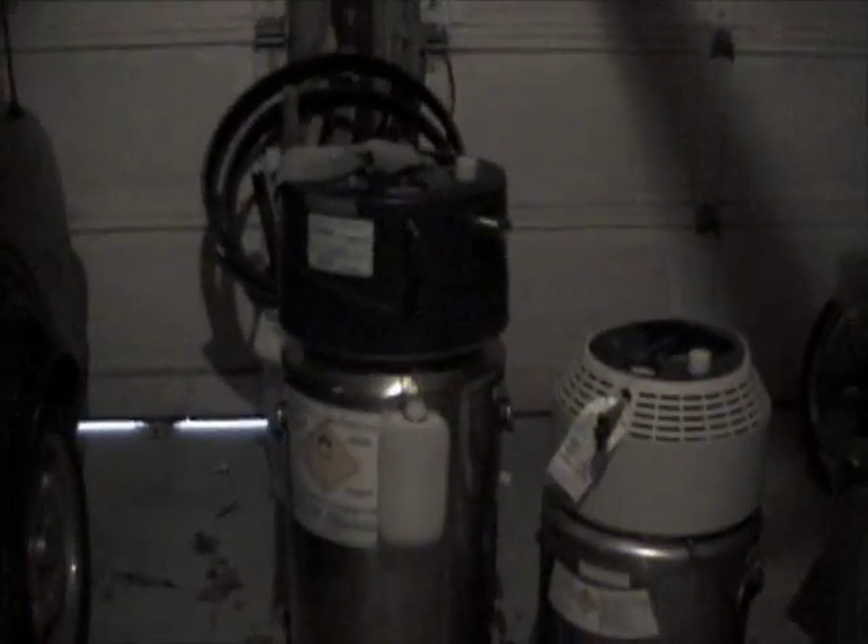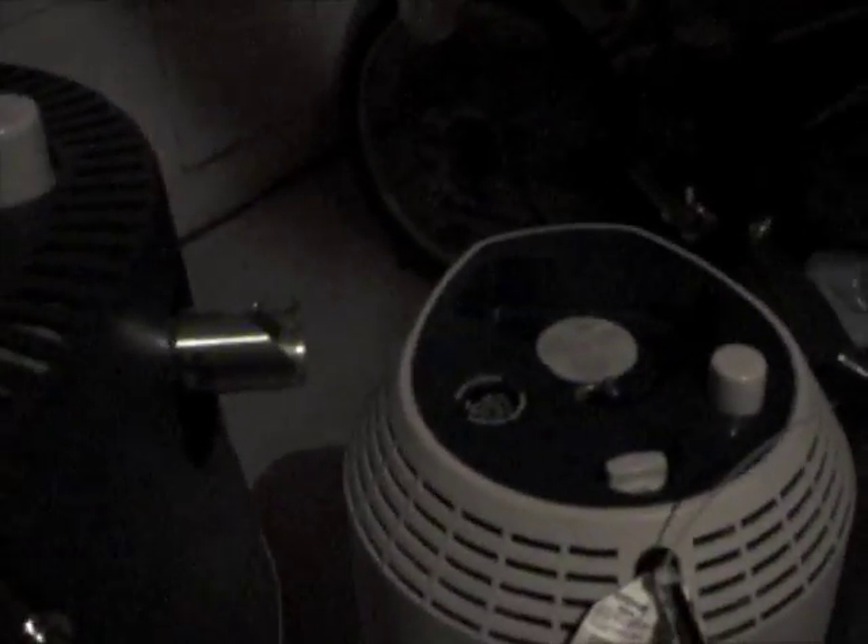Over here there is a silhouette of a regular sized garbage can so you can see how high a garbage can is. This is the smaller refill unit that they gave us near the end, so that we could have that in the back of our van all the time for refilling the little portables to commute into my medical appointments. That's the bigger unit over there.